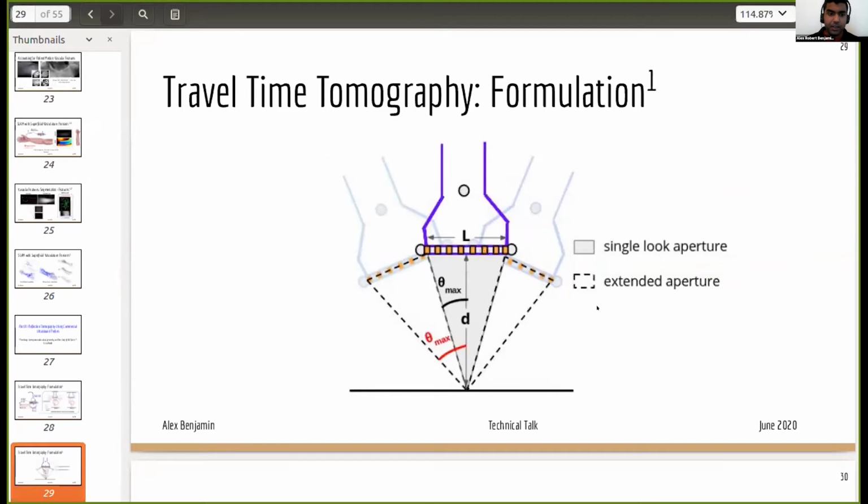But essentially one of the benefits that our framework has is, in the case of a regular probe, if you weren't able to track it, you really suffer from the fact that the viewpoint is limited. And when you have a limited viewpoint, you have much less information that allows you to reconstruct the underlying sound speed map. But if you're able to scan a wider angle, you start to get more information from more parts of the domain, which better constrains your problem, which allows you to better estimate the sound speed and slowness map.